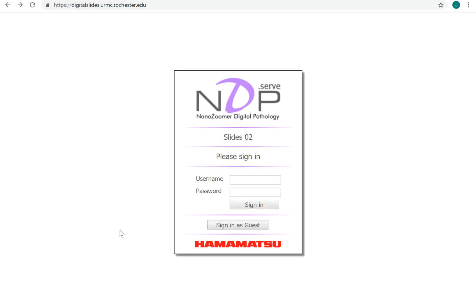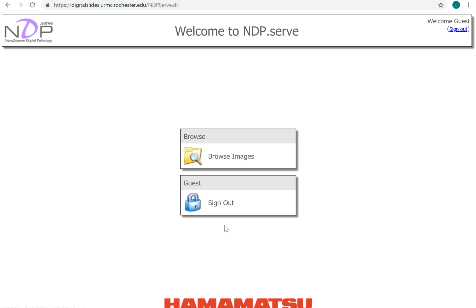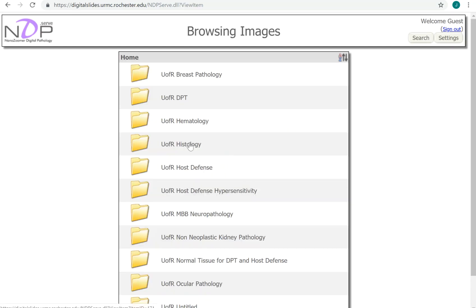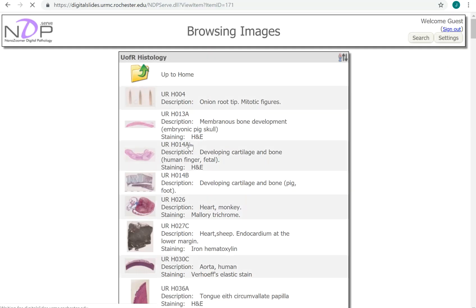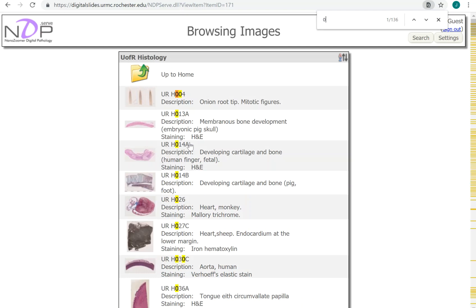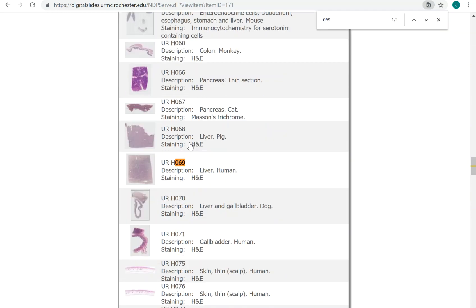Hi everyone, welcome to a little video that's a review of normal histology, in case you haven't thought about this since histology. Going to the digital slide site, signing in as a guest, let's browse images and go to the normal histology folder. We're going to look for slide number 69.